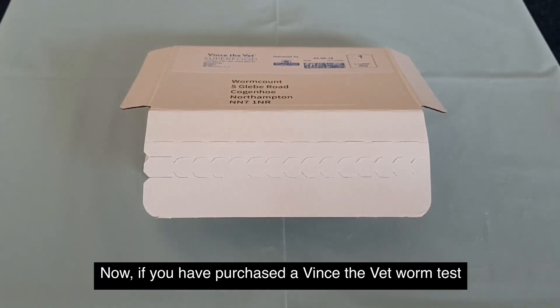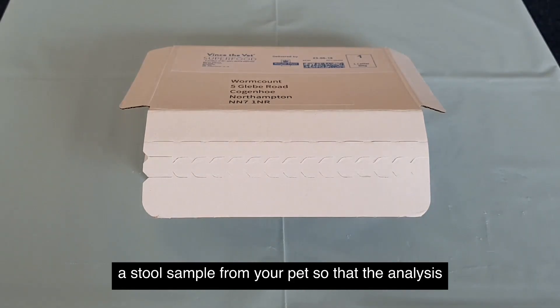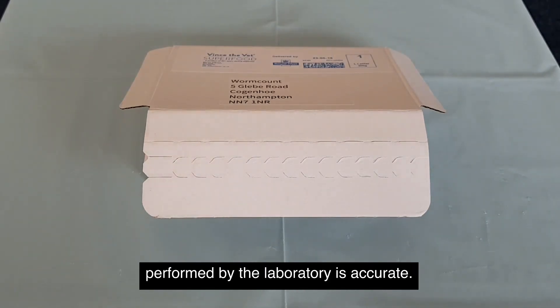Hi, welcome to Vince the Vet. If you have purchased a Vince the Vet worm test kit, this short video will show you how to correctly submit a stool sample from your pet so that the analysis performed by the laboratory is accurate.